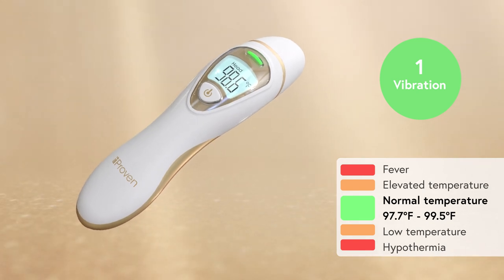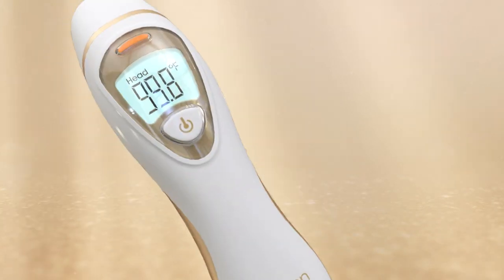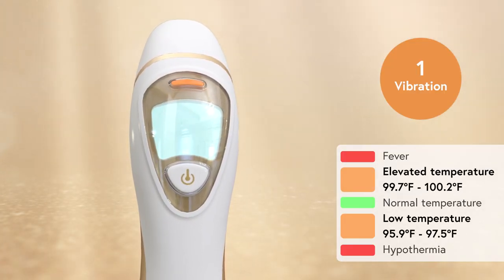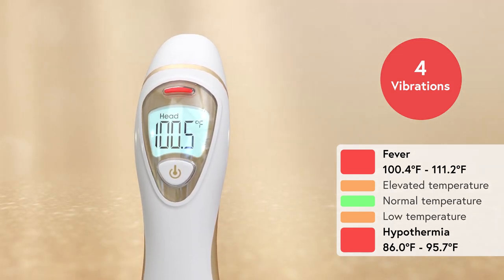It's simple to understand. A single vibration with a green light signals a healthy, normal temperature. An orange light indicates your temperature is a little higher or lower than it should be. Four gentle vibrations with a flashing red light means you have fever or hypothermia.